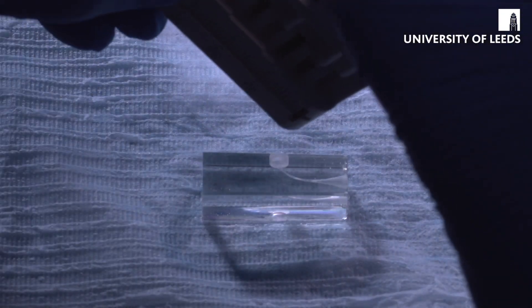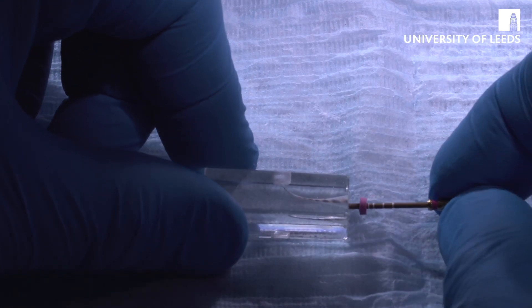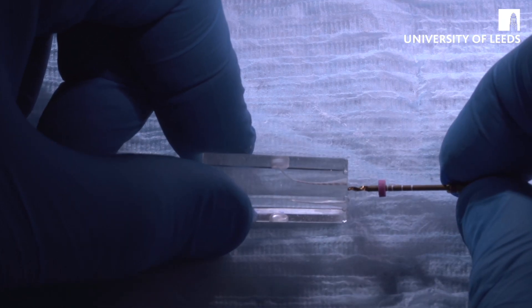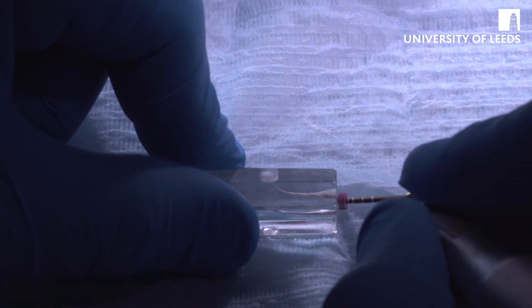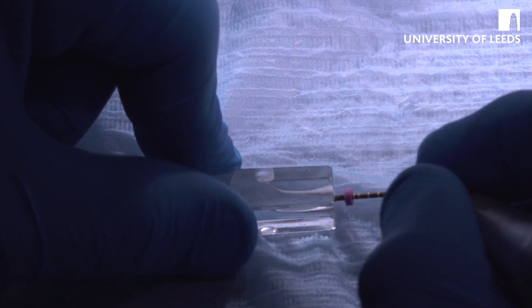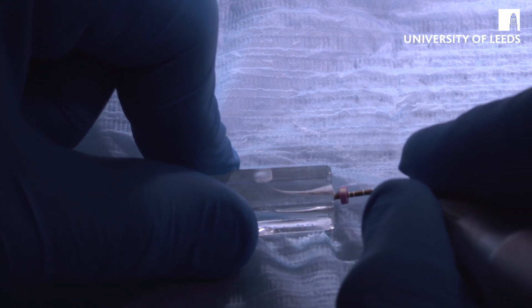Get the Shaper 1 file, measure it to the correct length. Just by hand for demonstration purposes, put it in and see where it goes — about one to two millimetres short of working length, which is fine. If it were three millimetres short, we'd have done insufficient coronal flare. Since it goes very easily to within one or two millimetres of working length, we can proceed. Passive insertion and working down — that file is now going to length. Use very, very light forces apically, and you can lean on it a little more laterally.